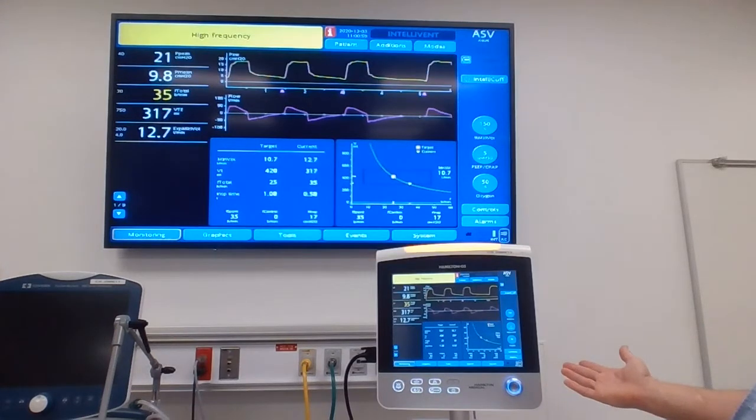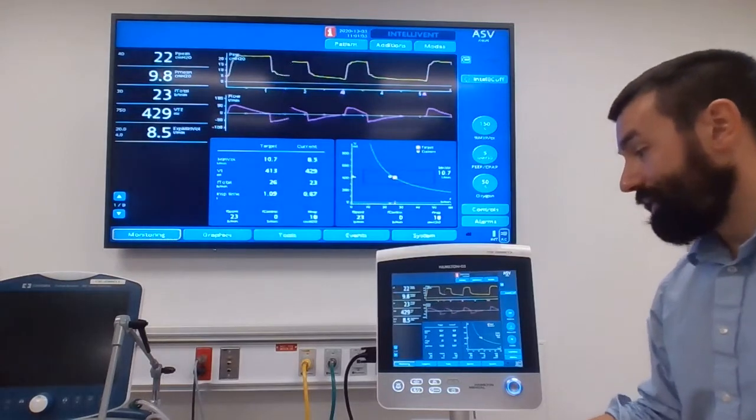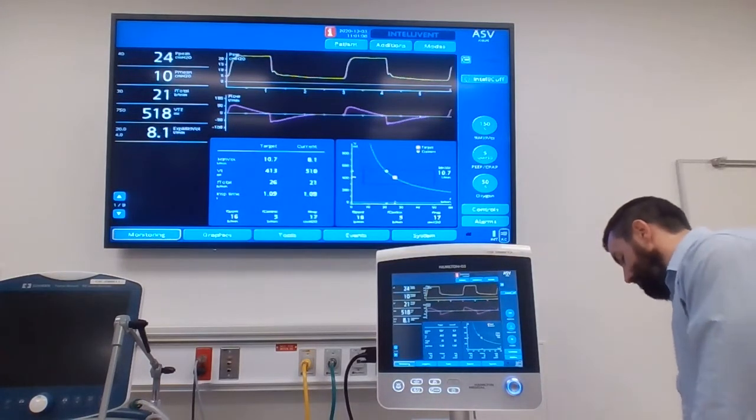If I stop breathing, it realizes that my minute ventilation is going to drop, and it's going to kick back in and give those mandatory breaths here again. All right, so let me fix my compliance again.